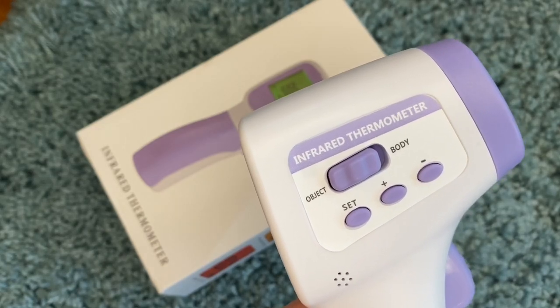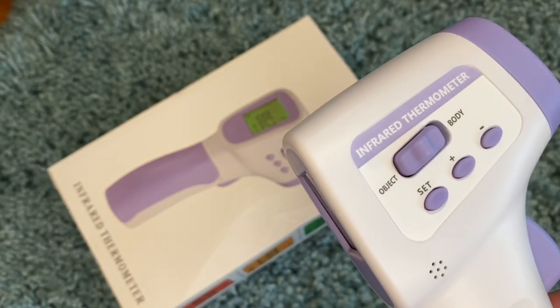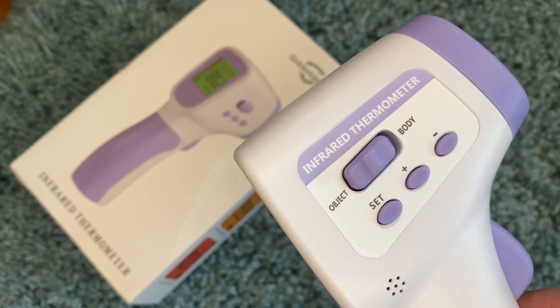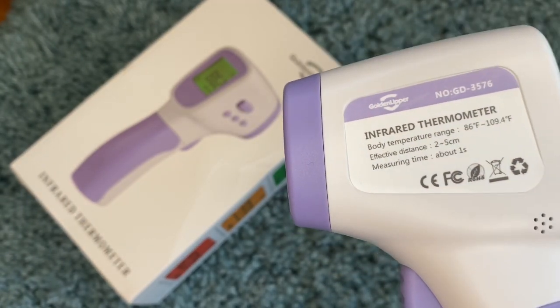Hey guys, it's Carrie Lynn here for SheSaved.com and as promised I am going to give you a peek at how to use this infrared thermometer. I've been sharing this on the Facebook page. These have been really hard to come by. This is the one I purchased — it's the lowest price I've found.